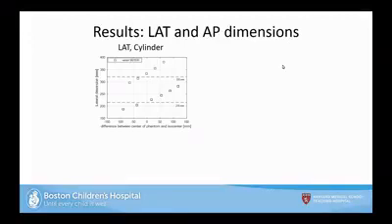And I plotted them all here. And we varied the phantom. We varied the table height. We had the phantom on the table, and we varied the table height. So for the vendor approach, as you can see here, these squares, the lateral dimension would vary with table height.